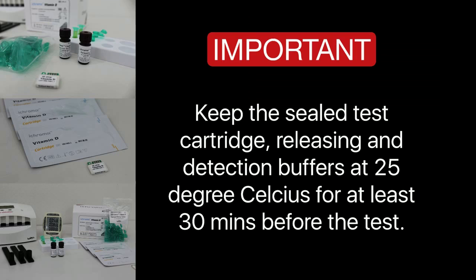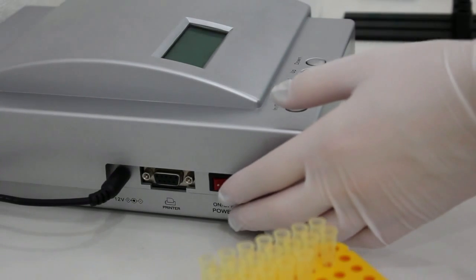After taking out from the refrigerator, keep the sealed test cartridge and the releasing and detection buffers at room temperature for at least 30 minutes before the test.